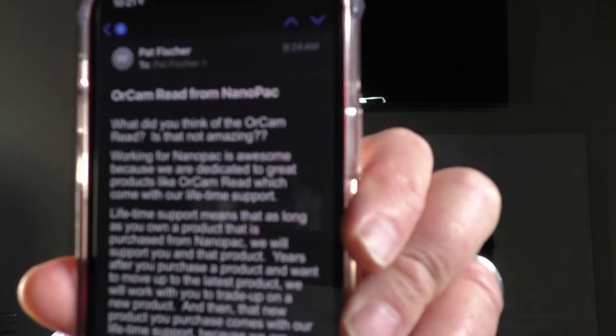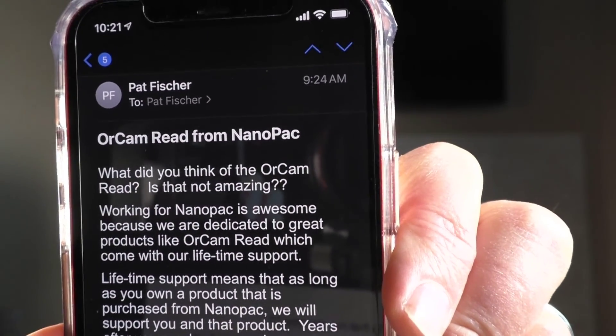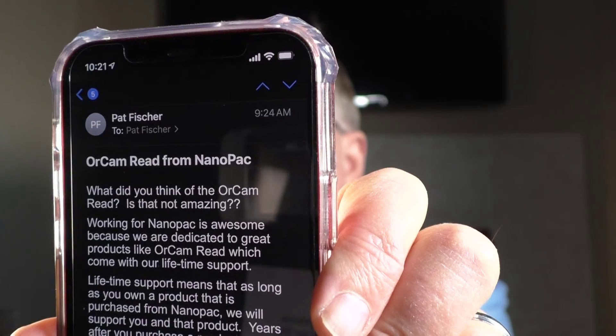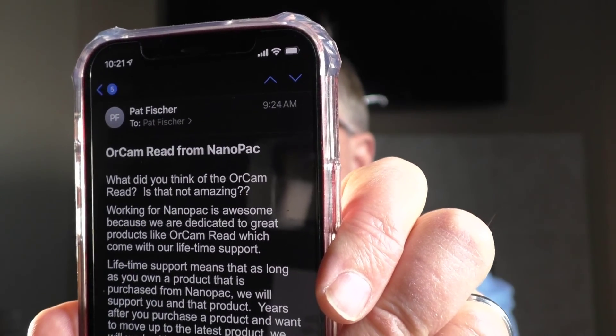One last demo I want to show you. The text in my video is on my iPhone screen and I'm going to have OrCam Read read it. The device reads: 'OrCam Read from NanoPac.' I double-tapped to pause it. Now I'm going to turn it on and fast forward just so you can see this. It reads: 'For Nanopac is awesome... after you purchase, we will work with you to trade up on a new product.' That is amazing — this is scan and read technology that is so responsive, so fast. There's nothing like it on the planet. This is a must-have product for someone who is unable to read print.